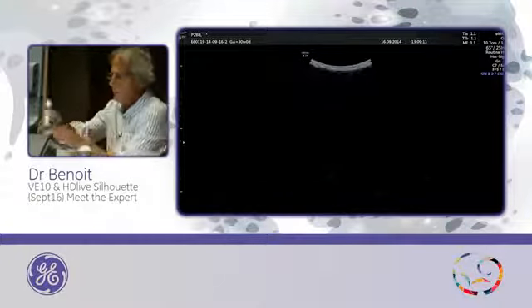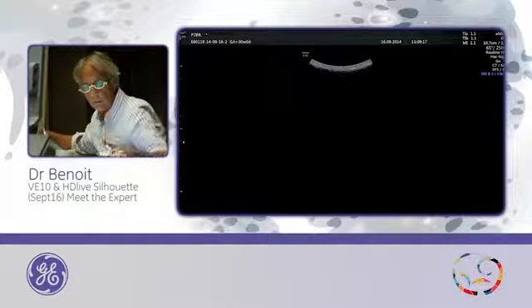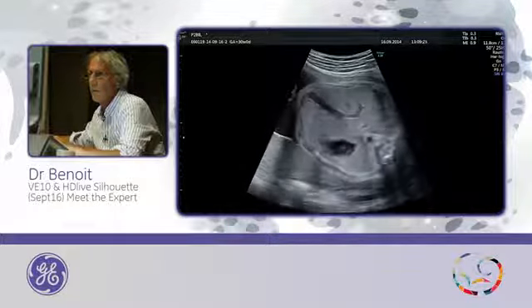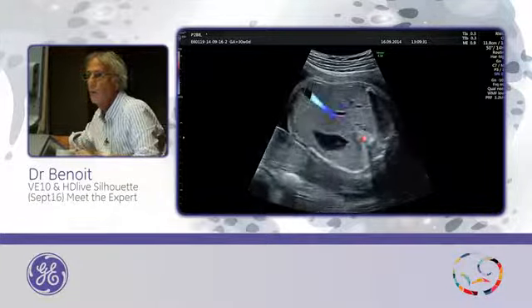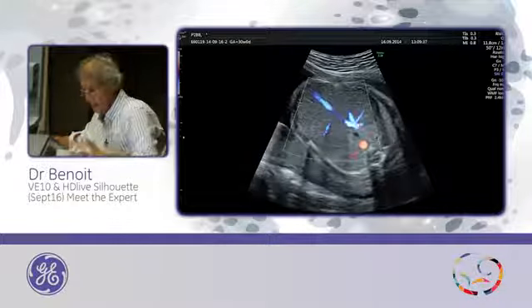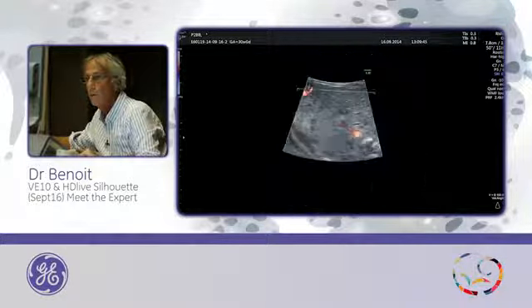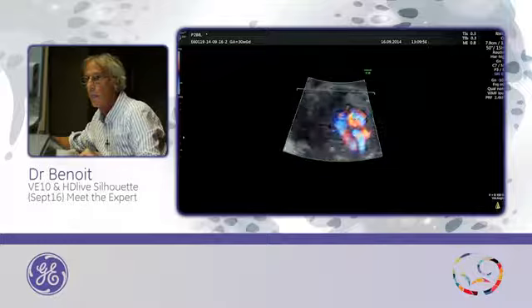If the baby is not moving, I will show you something nice: the vascularization inside the abdomen. Okay, so this is a portal vein, color Doppler. And start 3D, with glass body, start. And this is the result.